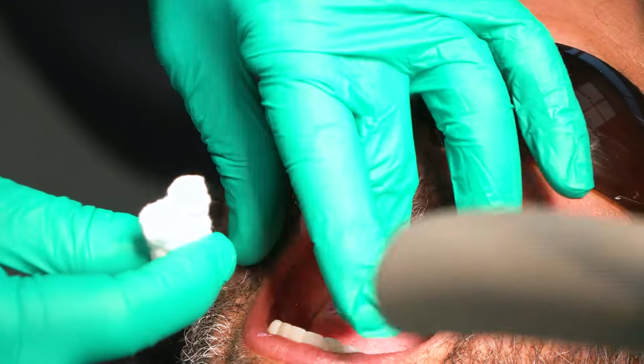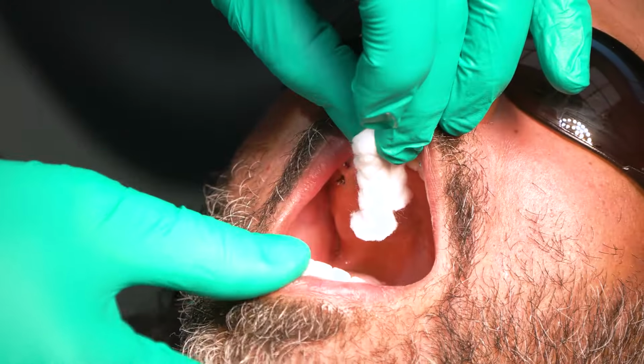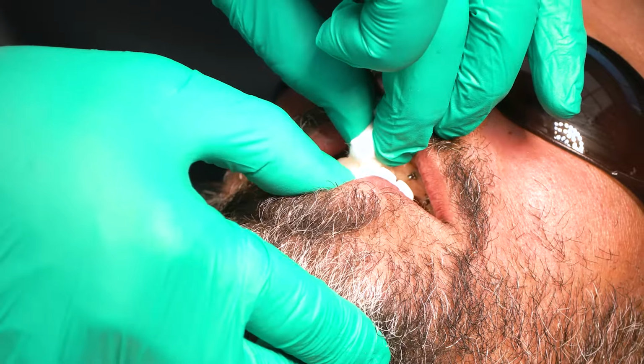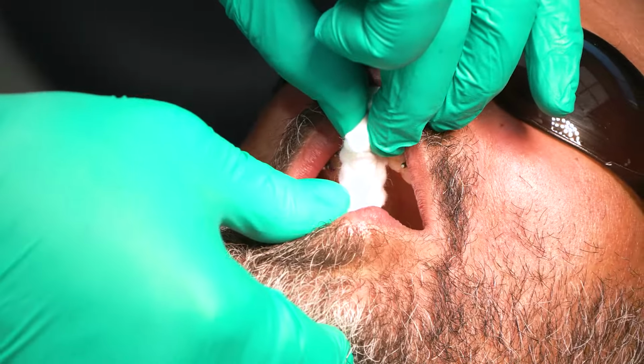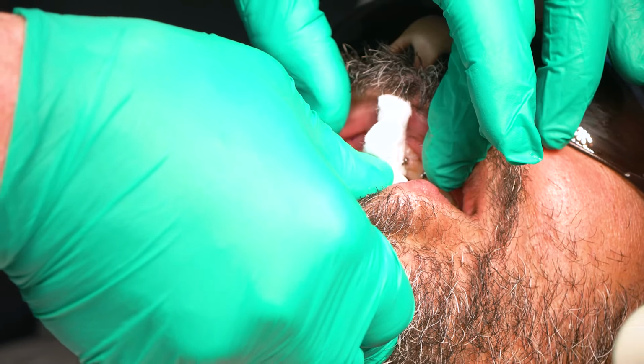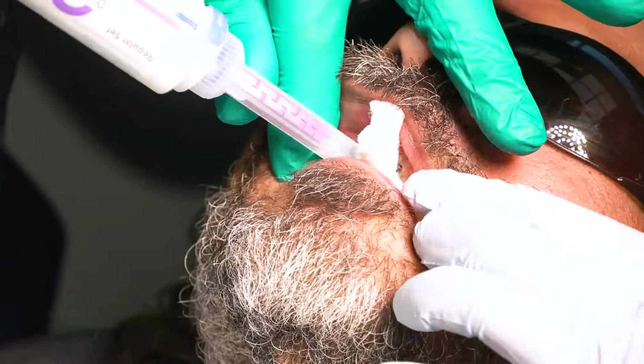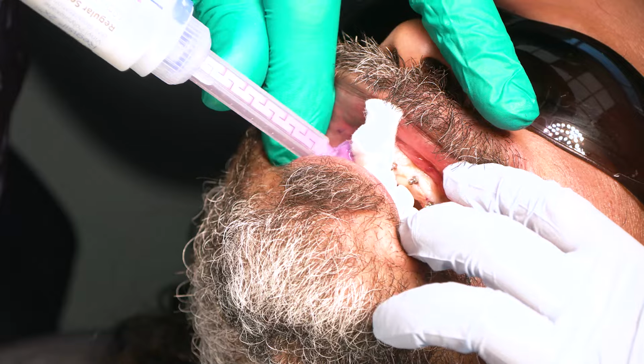So this is my cotton roll bite. What I do is I put two cotton rolls, have the patient bite together, not too hard, open. Relax your jaw and just bite gently. Okay, hold it right there. Don't move. Bite a little tighter. Hold it right there. Squeeze a little bit. Stay really still.